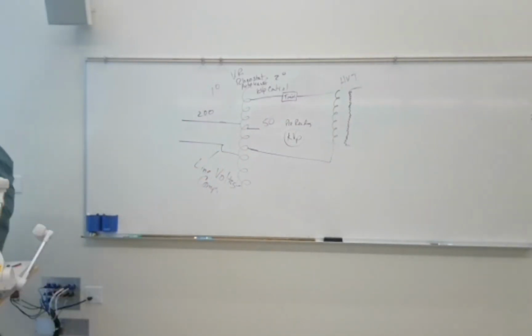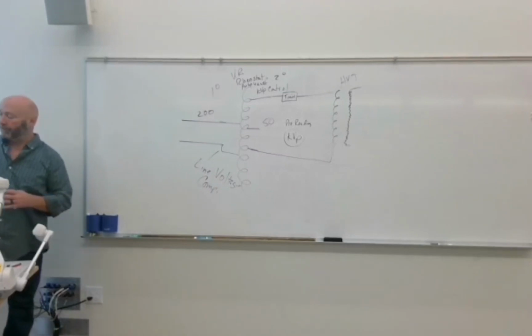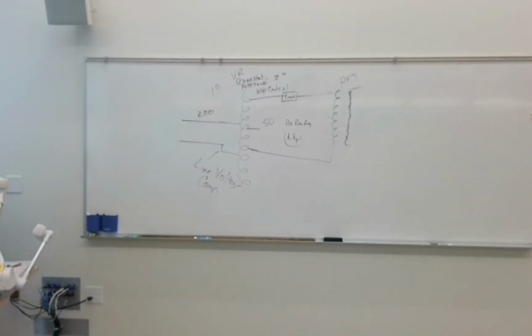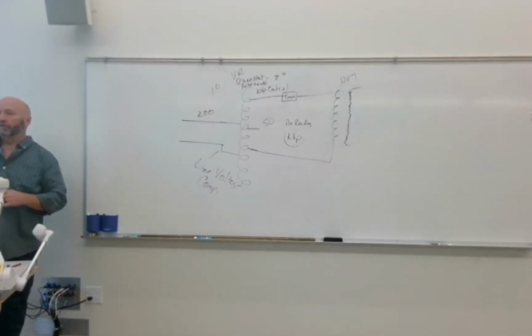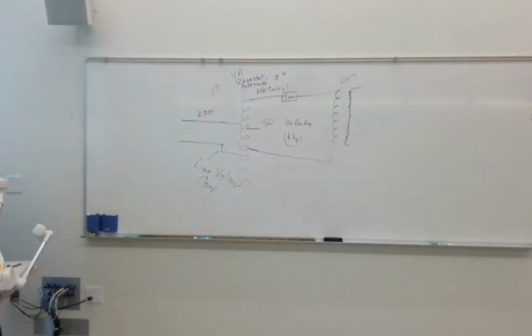So I'm going to refer you back over to page 111. And this is how I'm going to draw the circuit out on the test. Okay, so you've got the control console, then you get the high voltage section, and you have the X-ray tube. And in the chapter, Bushong is going to refer to the control console portion of the circuit as being low voltage, which it is, lower voltage than the opposite side, the high voltage section.